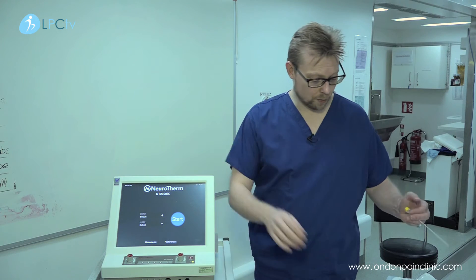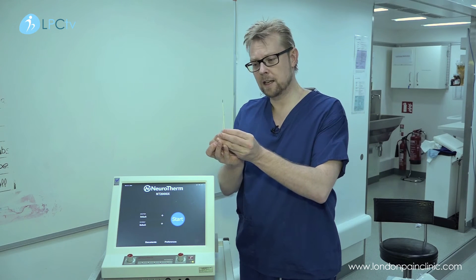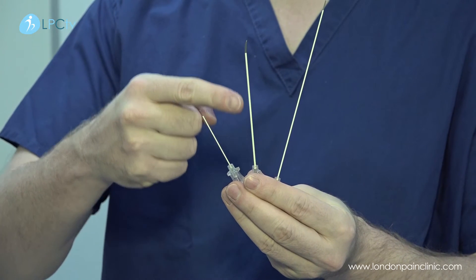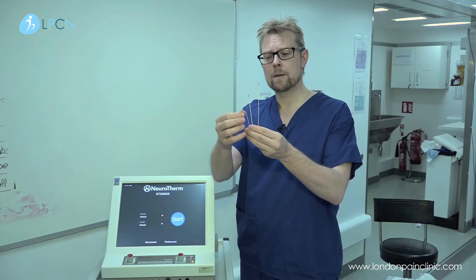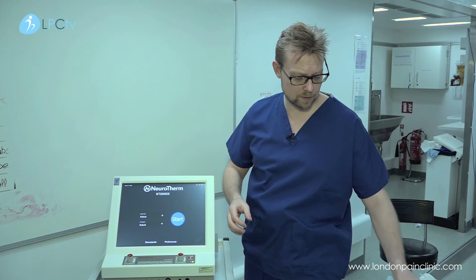For the procedure we use radiofrequency cannulae — here are three of them. As you can see they are in different lengths: short one 5 centimetres, longer one 10 centimetres, long one 15 centimetres. These ones have straight tips, this one has a curved tip, and there are various other ones that we use.